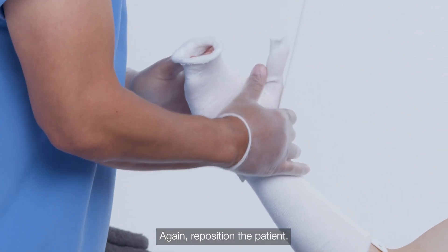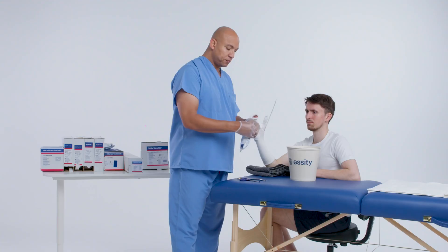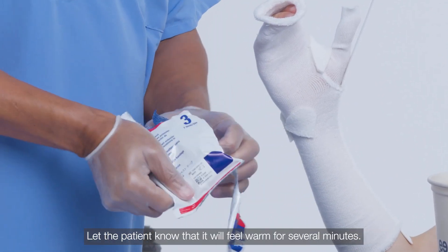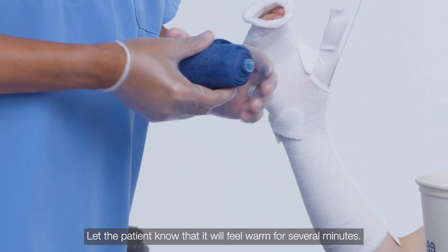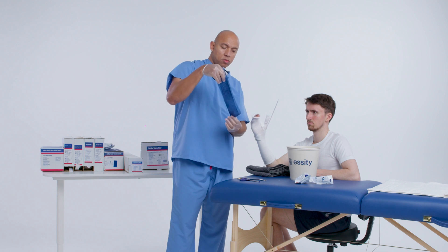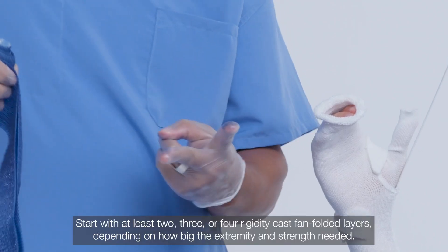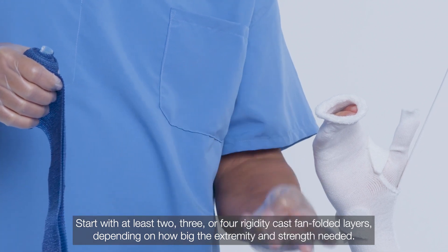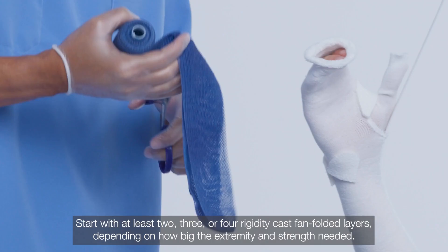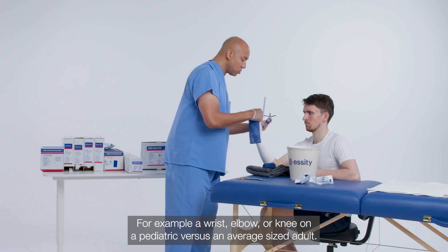Reposition the patient. Open up your roll of cast tape and first make your rigidity layers. Let the patient know that it will feel warm for several minutes. Start with at least two, three, or four rigidity cast fan-folded layers depending on how big the extremity is and the strength needed — for example, a wrist, elbow, or knee on a pediatric versus an average-sized adult.